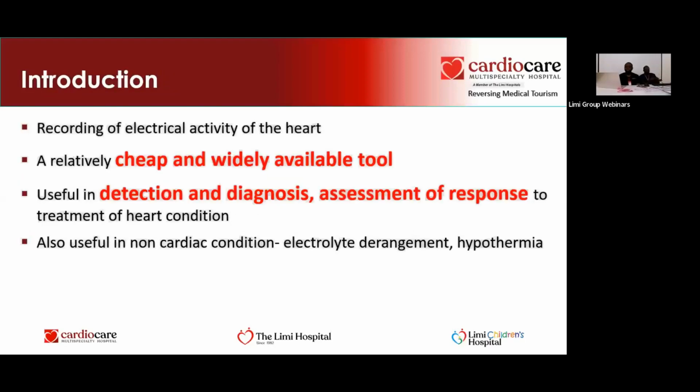ECG is a relatively cheap and widely available tool that you need to record the electrical activity of the heart. By doing that, you can gain access to a lot of information about the heart, or even infer some from other conditions that are not mainly heart related. So you can get signs of electrolyte derailment, heart attack, arrhythmia, and all other things.